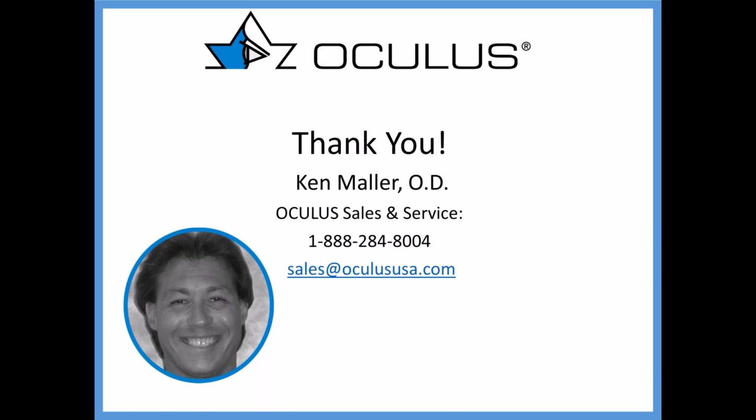Excellent, excellent. Does lid tightness play any factor as far as your Pentacam measurements? Are you concerned about lid tightness, or is it a non-factor for you?